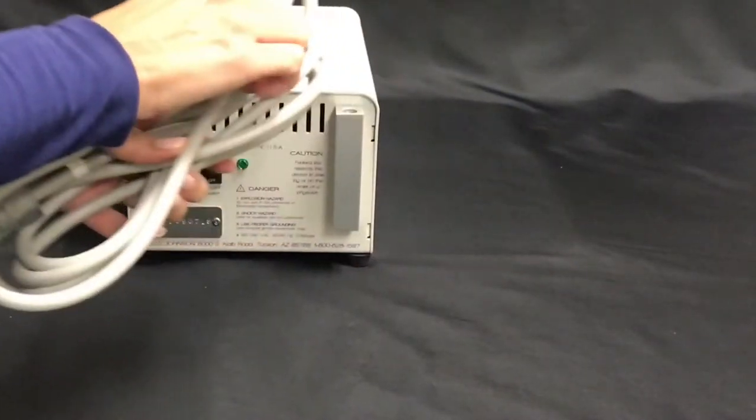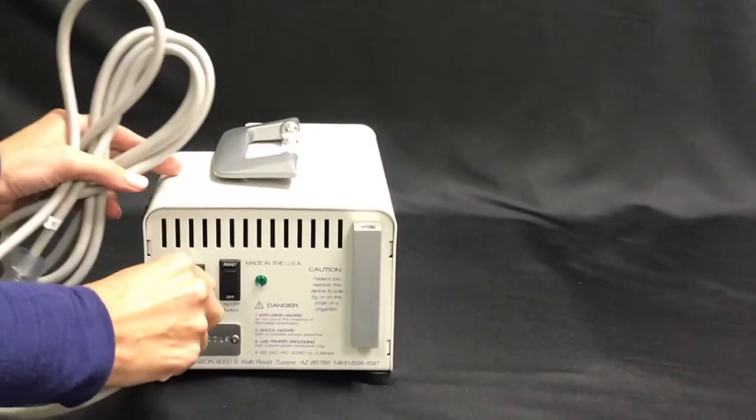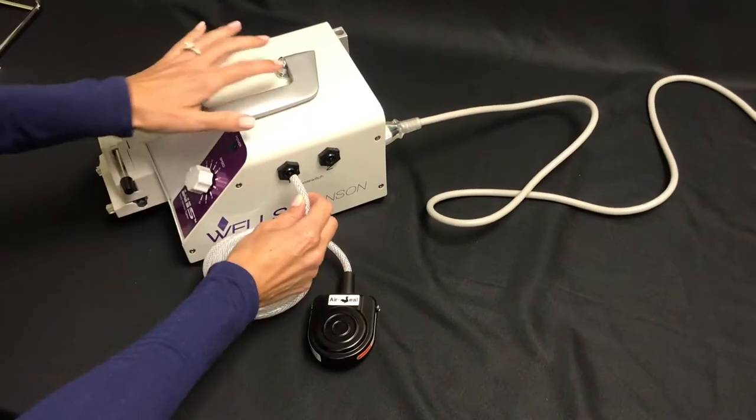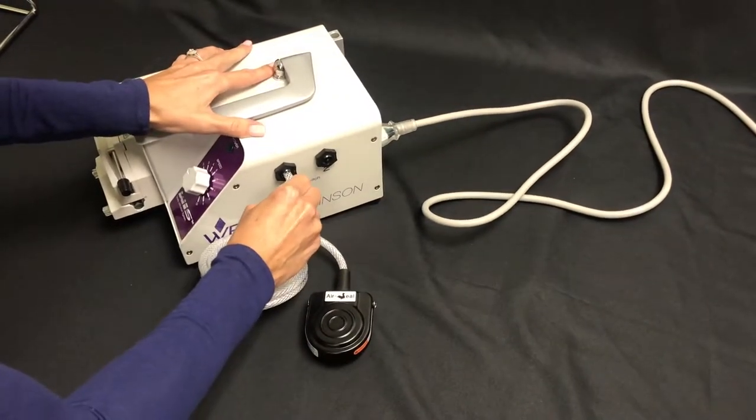To start, plug the power cord into the back of the infusion pump and plug into a power outlet. The footswitch can be connected to either hose barb on the side of the pump.